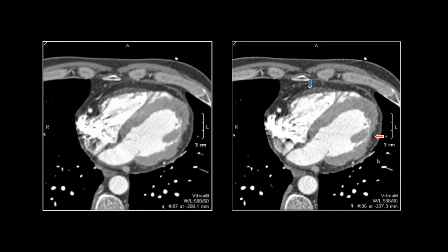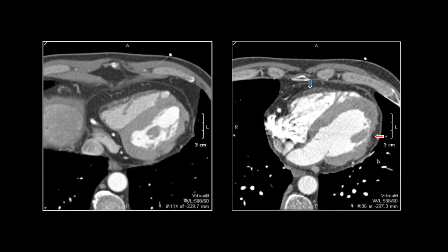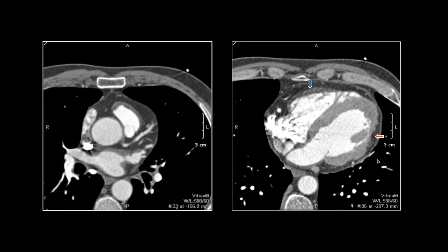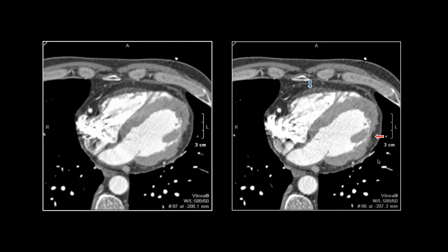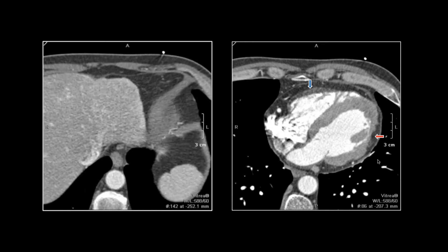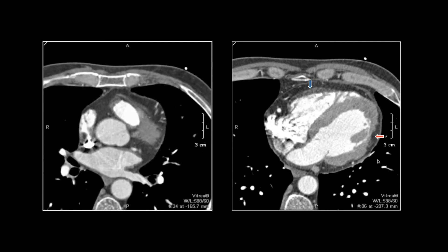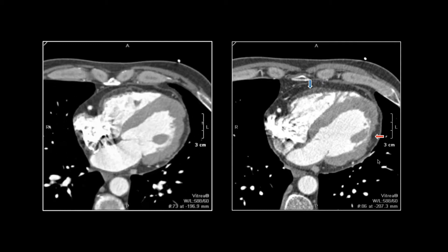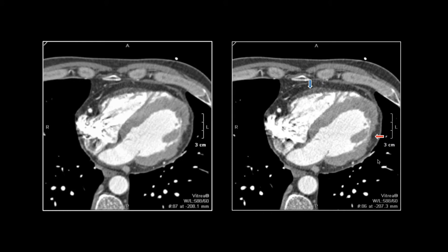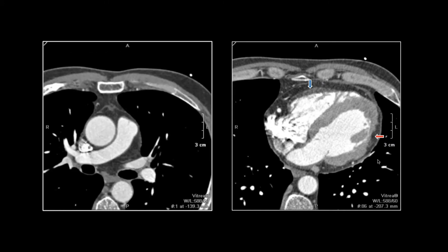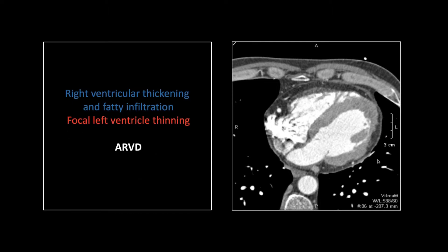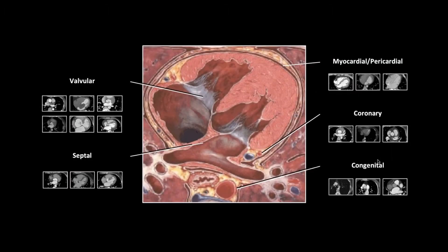Very nice depiction of it. Look at that thickening and fatty infiltration of that right ventricular wall — it's throughout the entire extent of the RV. I didn't annotate this one because I figured you could all find the right ventricular myocardium. Then look at that left ventricle: that irregular thinning in the left lateral wall and along the inferior aspect. So that is ARVD, arrhythmogenic right ventricular dysplasia.